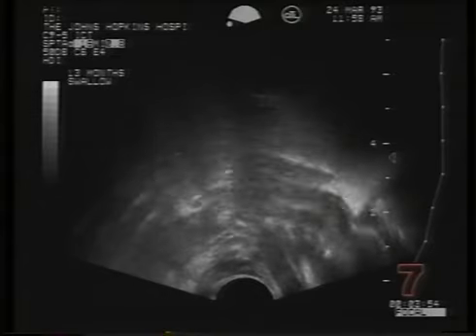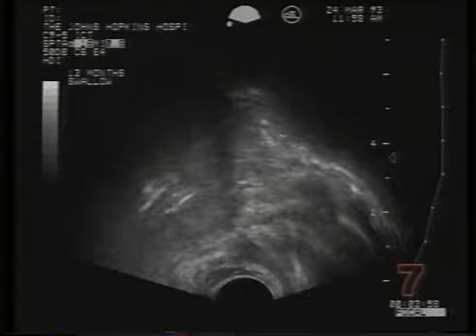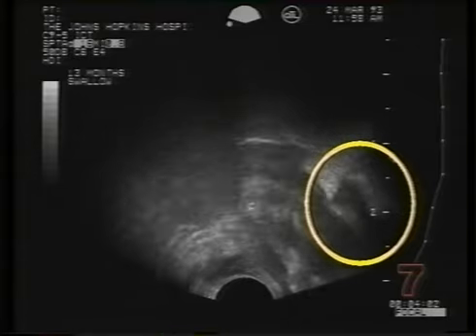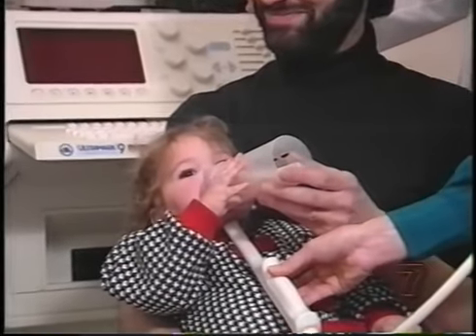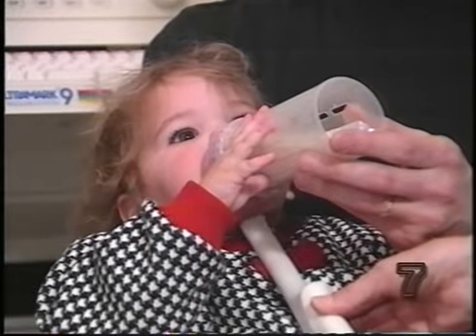Ultrasound imaging can also be used to image children swallowing, or even babies swallowing from a bottle, in which case we see the tongue deforming around the nipple of the bottle. This is an advantage because there are many procedures that are unpleasant for children to have to experience, and ultrasound is a pleasant, comfortable procedure. Children don't mind using it.